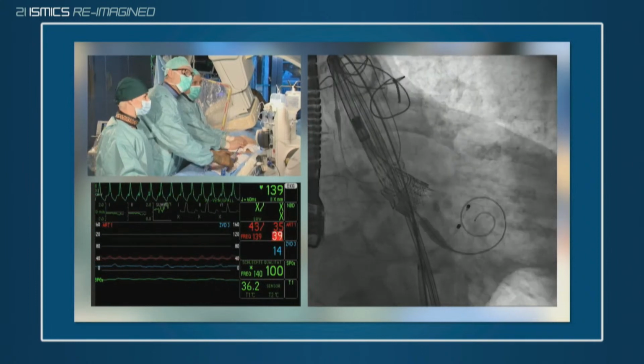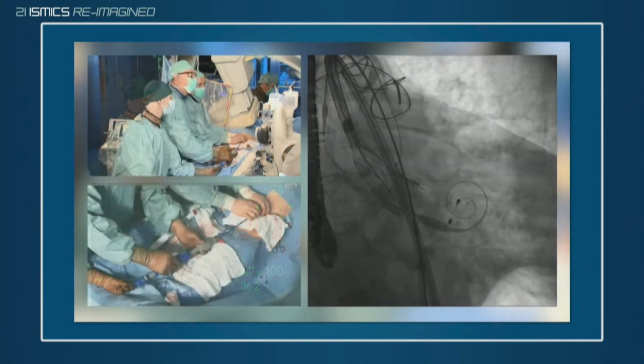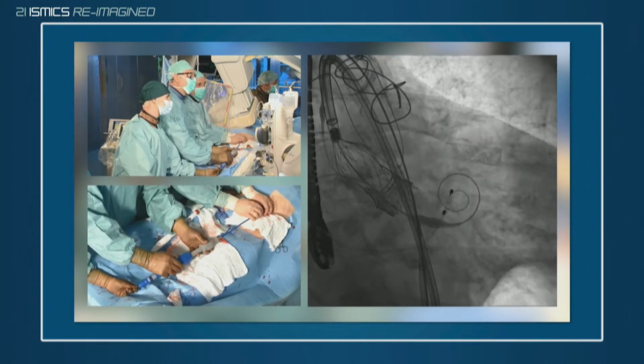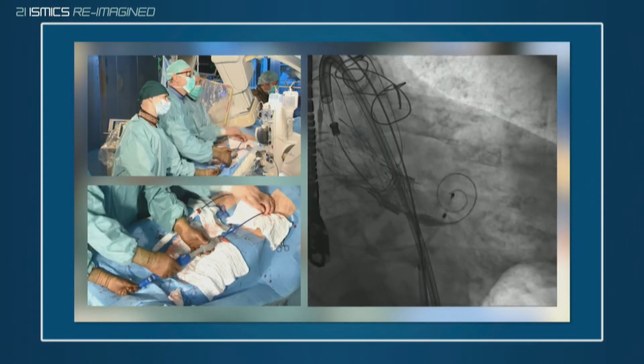We should do it like it is? I would say. Okay, I think we are a bit low, but I think it's not too bad, so we're going to release the valve now. It's going to snap down, and hopefully the left coronary side is going to move up, because in the stent it probably can't go down. Yeah, I think it's good.